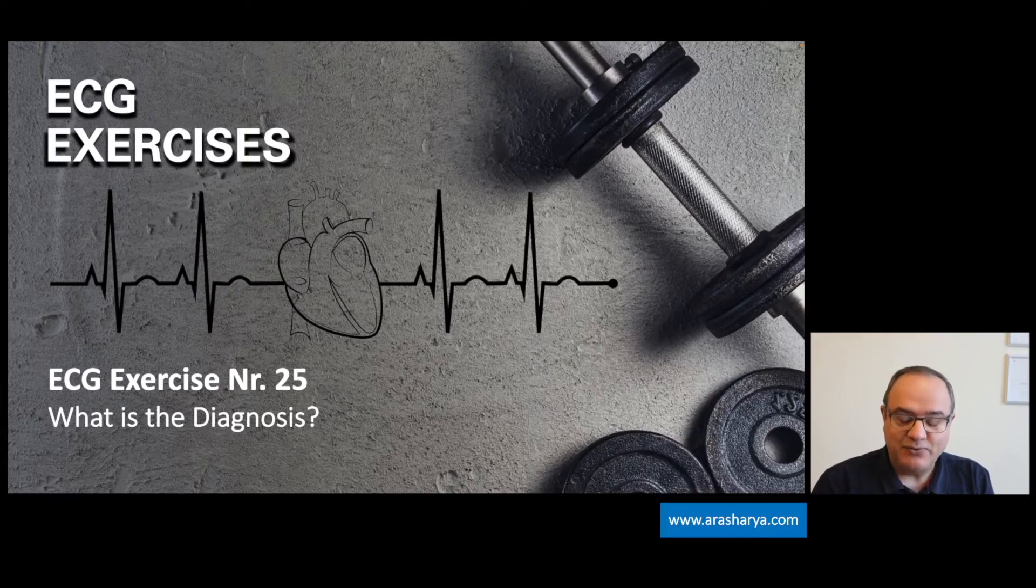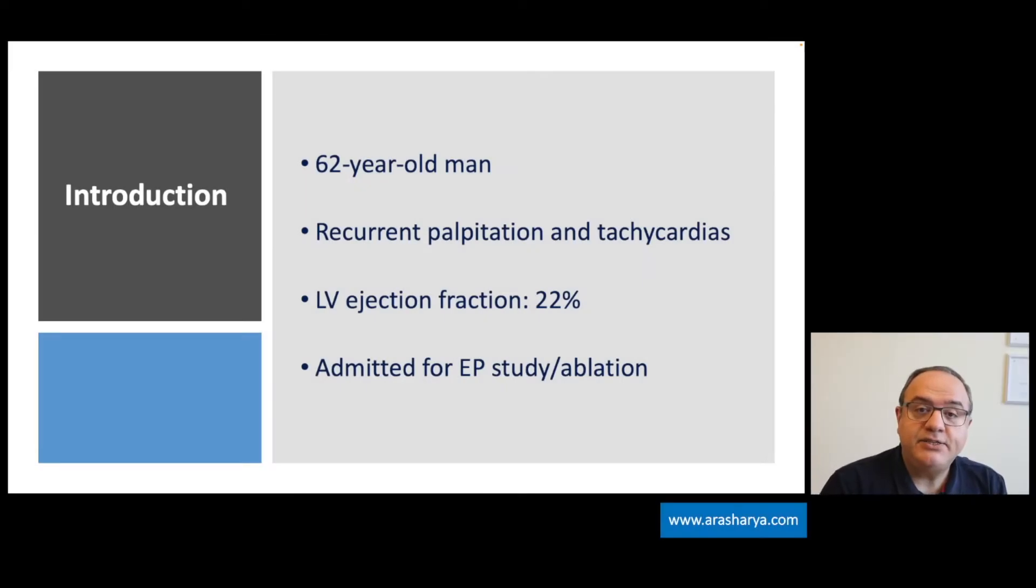Today's ECG belongs to a 62-year-old man who was admitted to the hospital because of recurrent palpitations and tachycardia. In past medical history, he experienced old inferior wall myocardial infarction. Echocardiography showed an ejection fraction of 22 percent. The patient then was referred for EPS study and VT ablation to our center.